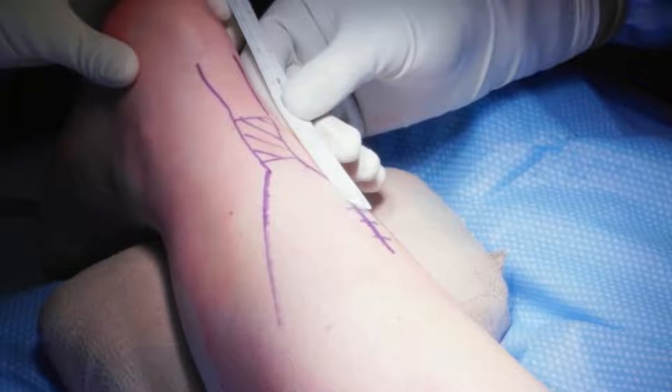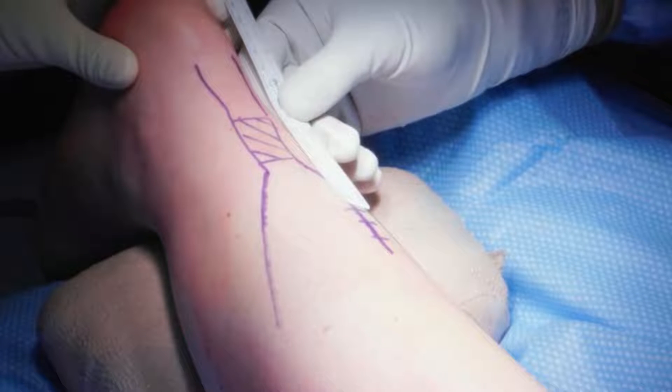With the patient in semi-prone positioning, the Achilles tendon is mapped proximal and distal to the site of rupture.